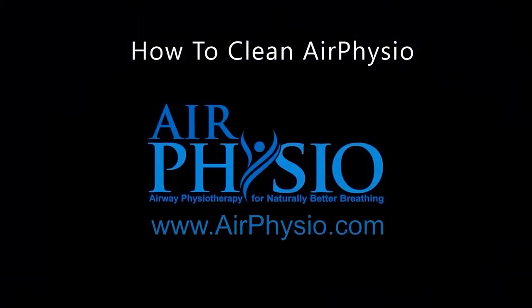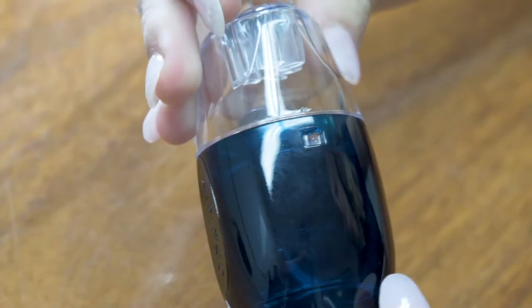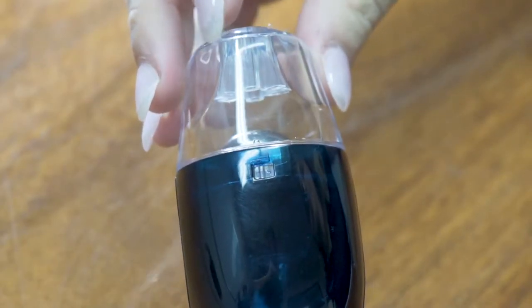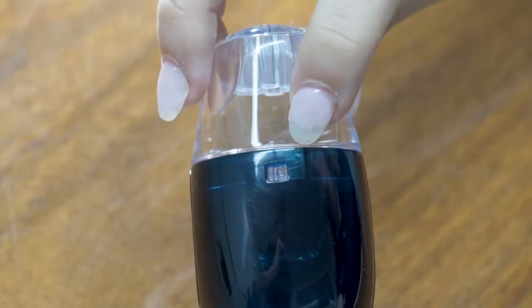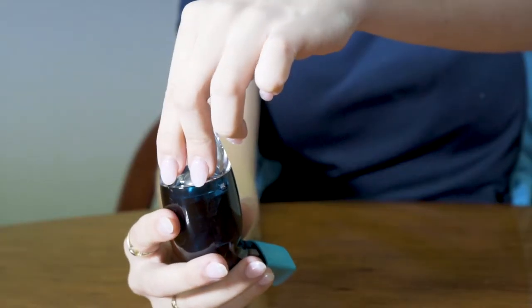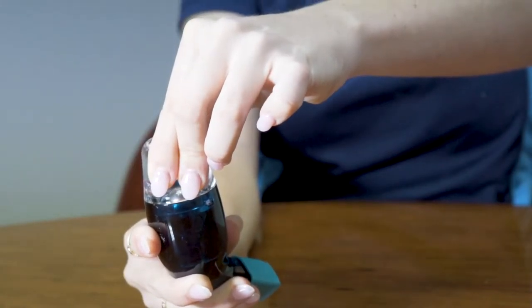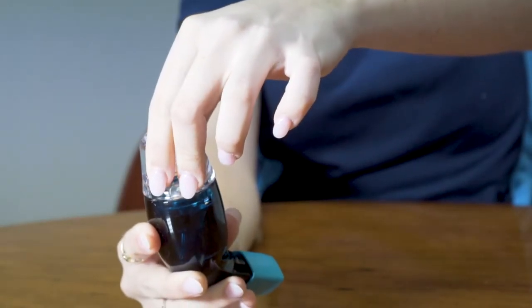How to clean your Air Physio device. Check your Air Physio device — if it does not have a notch on either side, it's a twist cap. The cap simply twists a quarter of a turn and you can lift the cap free from the body.